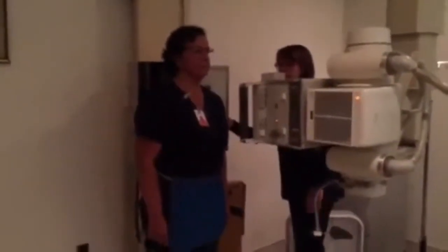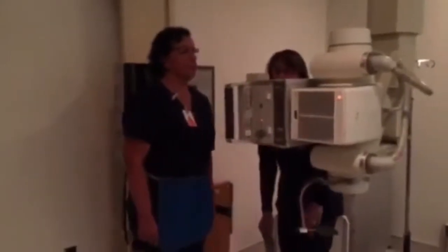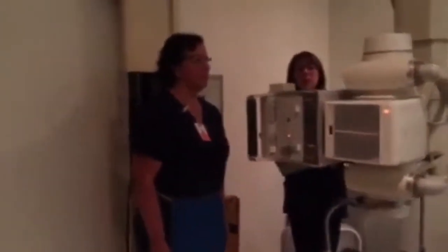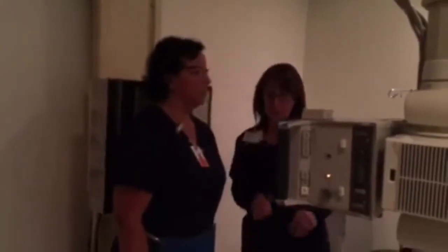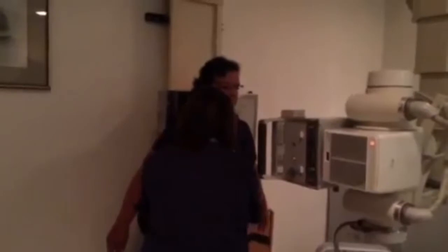Take my cassette out, I'll set it to the side, I'll grab a new film. This time we're going to be doing the scapular Y view, and I will have my film in portrait. Okay. I am going to turn, step forward just a bit for us. Okay. Is that okay? Yes.